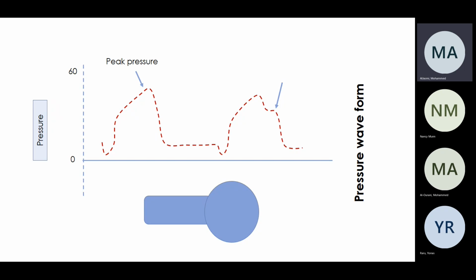There is no dynamic status. Is that right? It's only static right now. There is no air moving. So that's what we call the static status in here.